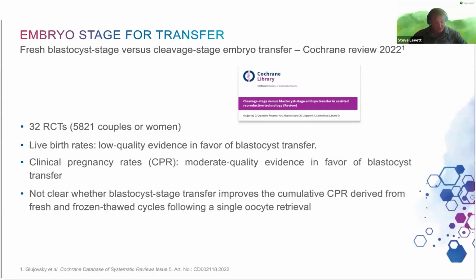Which stage is better? We've generally moved now as an industry, as a profession in embryology, to doing blastocyst stage transfers, partly driven by the desire in some places to do genetic testing, but others because they believe it's a better way of selecting embryos. But when you look at the data and the published data, a relatively small number of randomized control trials give relatively low quality evidence in favor of blastocyst transfer.